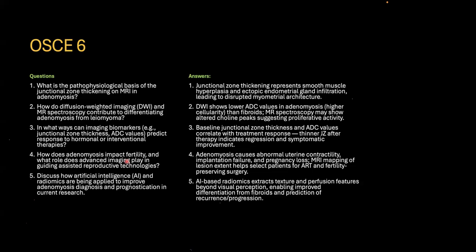So DWI will represent high cellularity in case of adenomyosis, and MR spectroscopy will show the altered choline peak, suggesting proliferative activity. In what ways can imaging biomarkers predict response to hormonal or interventional therapies? So, baseline junctional zone thickness and ADC values correlate with treatment response. Thinner junctional zone after therapy indicates regression and symptomatic improvement as well.